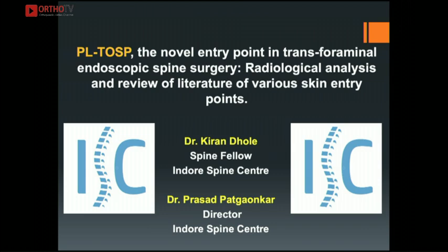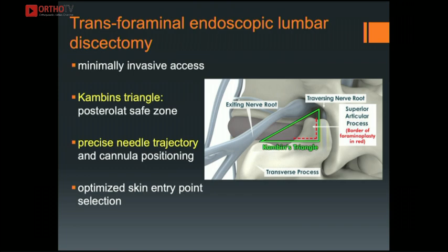Myself, Dr. Kiran Dhole. So this paper is about a novel entry point in transforaminal endoscopic spine surgery called PL-TOSP. Transforaminal endoscopic spine surgery provides a minimally invasive access through the posterolateral safe zone as given by Kambin.